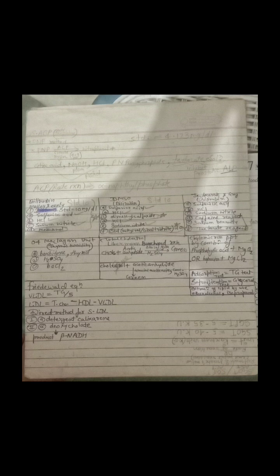Here the PNP method is used. PNP reacts with ACP in the presence of citrate buffer 4.9 pH and forms nitrophenol.